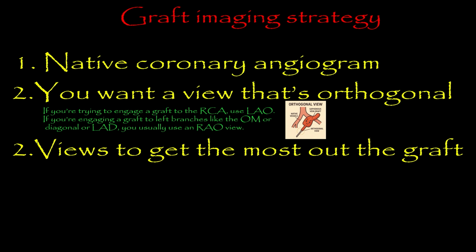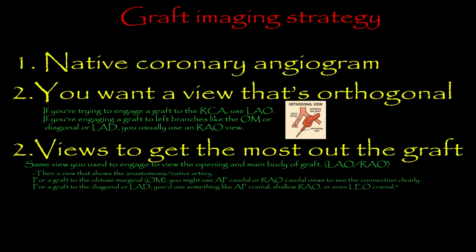So we want to know the main views that will get the most of our grafts. Usually the straight LAO or RAO view that we use to engage the graft is perfect for seeing the graft opening and the main body of the graft. But we also want a view that shows the native artery, where the anastomosis is. The anastomosis is where the graft connects to the coronary artery.